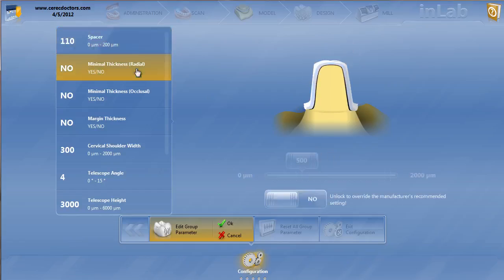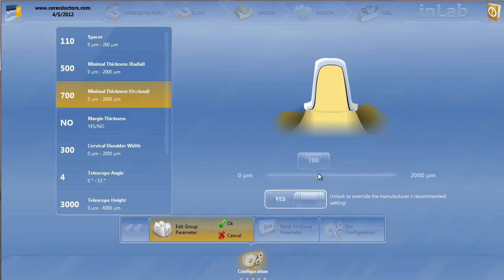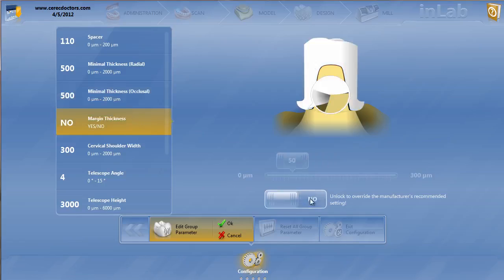Minimal thickness, again, this is always the same. You guys know what these parameters are. I generally like half a millimeter when I'm making any sort of framework or telescope. Margin thickness, I might up just a little bit.